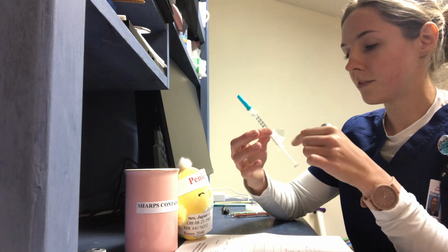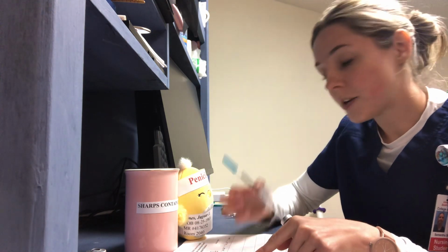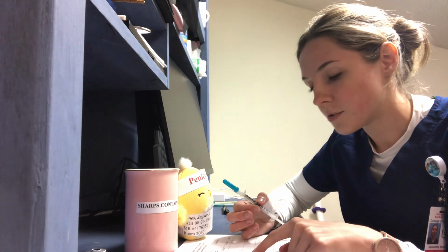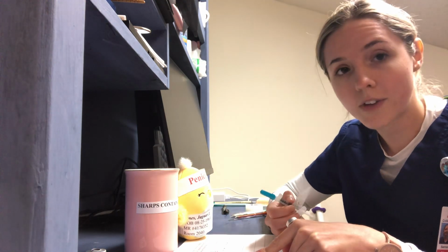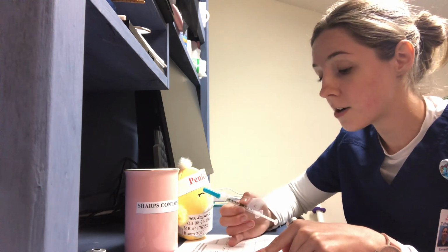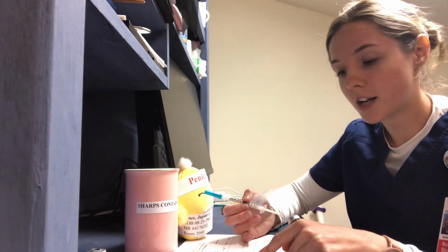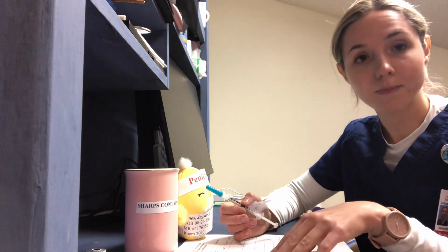And we do have 1/2 milliliter. Our label is correct. Subcutaneously, we have the correct needle for the right route, every 12 hours for the right time. And he has not had this medication in the past 12 hours, so he is good to go. And the right indication to prevent blood clots, right documentation, everything here is documented correctly, nothing is missing.